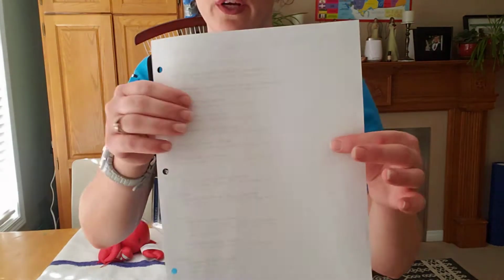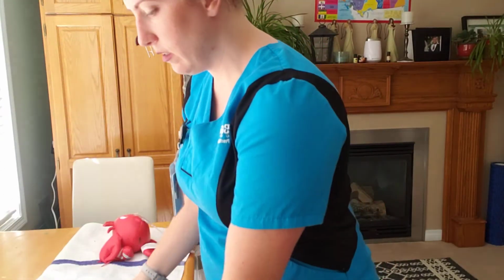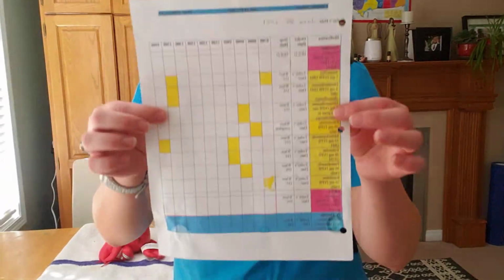This is part of the order. Another part of the order. Final page of the order. And finally, the MAR.